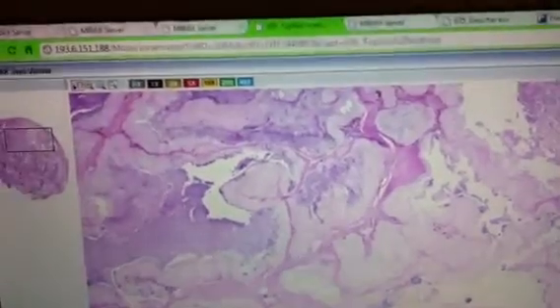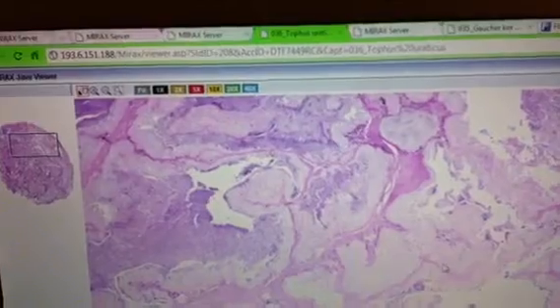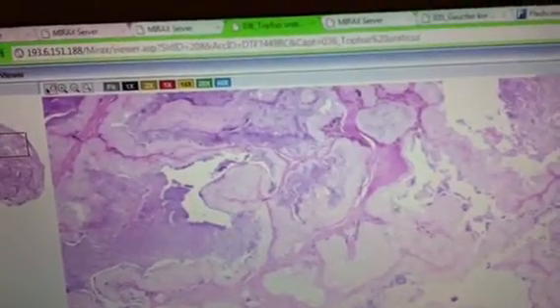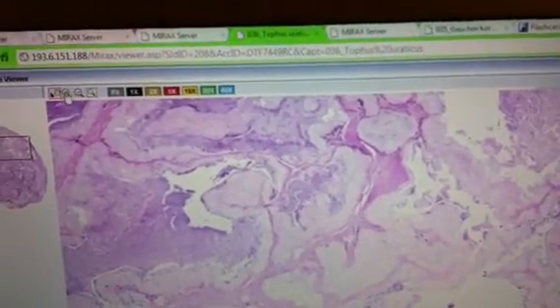But this basophilic area here shows, if you look at it, there's this imprinting on it that is the mark the crystals left there. So you see here it's very needle-like, clearly something was there, it is visible.